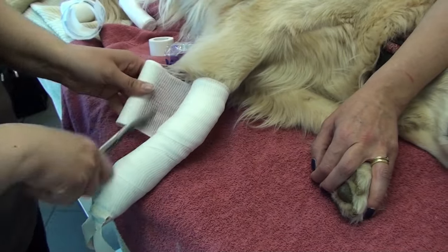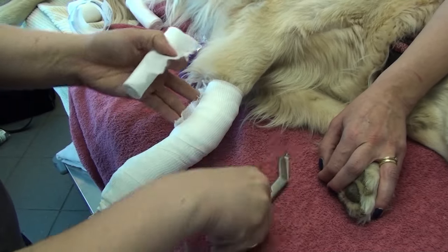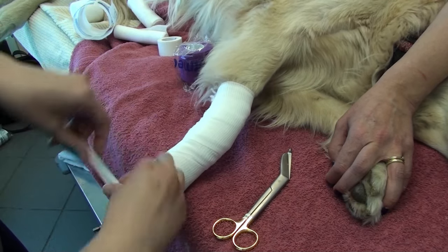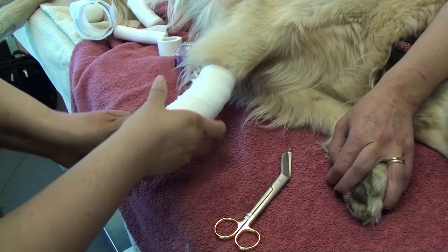This doesn't mean they have a problem with their carpus — it means we don't want them to weight bear on that forelimb, for whatever reason, whatever the problem may be in that forelimb.